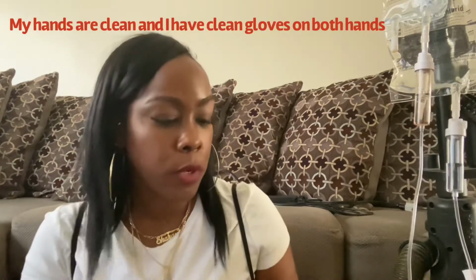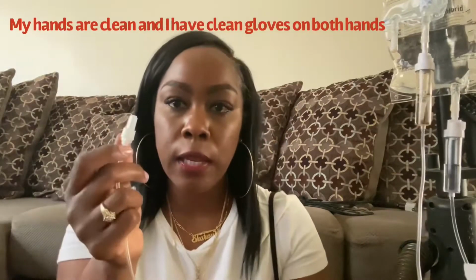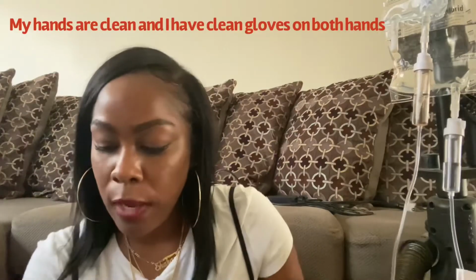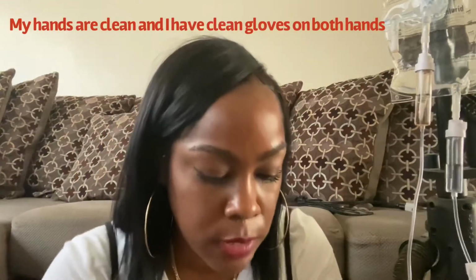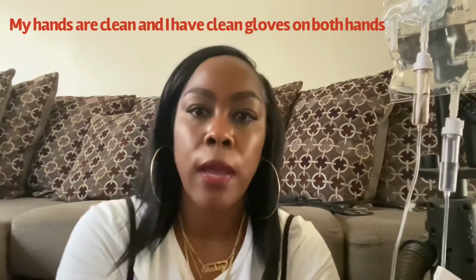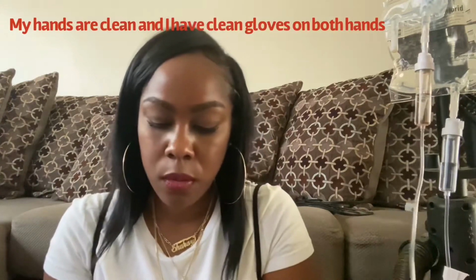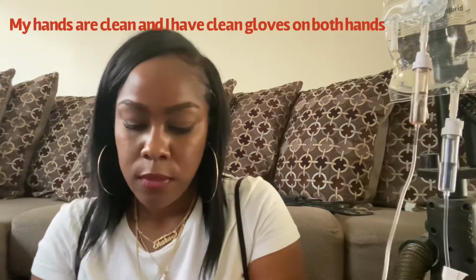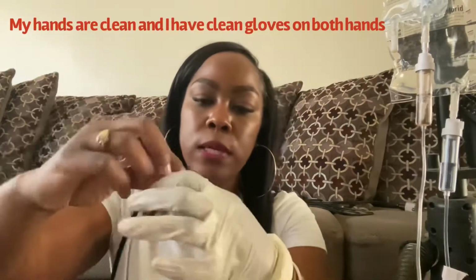And then what we're going to do is connect this to the white port right here. But the only thing about it is we have to take our alcohol wipe, because of course it's been out for a while. So we have to make sure that we clean it. I'm going to take this, don't touch it, of course. We're going to connect it. The thread right here is going to connect to it.